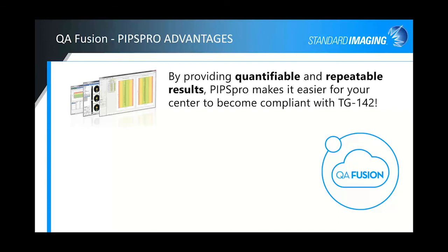So our PIPSpro advantages, as I mentioned, everything is quantifiable. It's not a qualitative test, and everything gives you repeatable results. PIPSpro makes it easier for your center to become compliant with TG 142 for those accreditations and inspection audits, things like that.